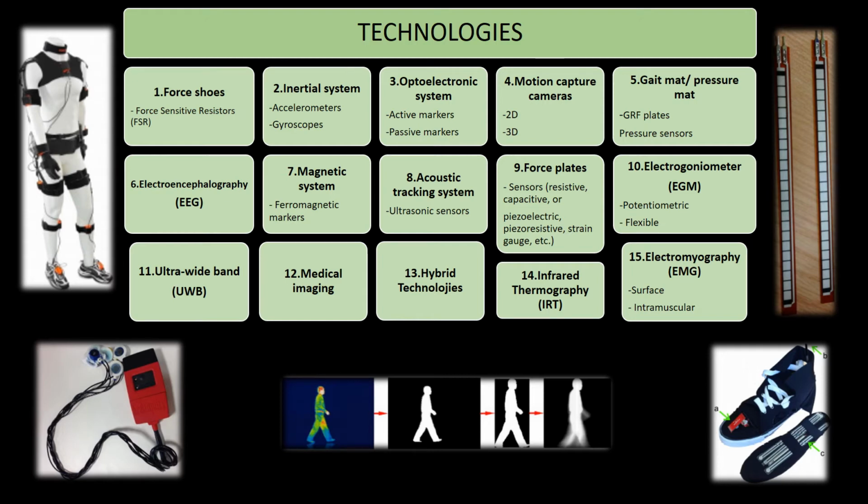Another technique of human gait analysis is well known, where active or passive markers are attached to the points of interest of the human body. These marker points are traced by optoelectronic systems that convert the emitted or reflected light signals from the markers into electrical signals. These electrical signals are used to construct models for gait analysis. For quicker movements, accuracy decreases because of the sampling rate.